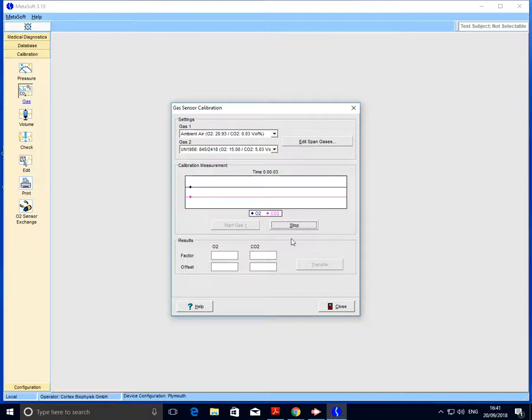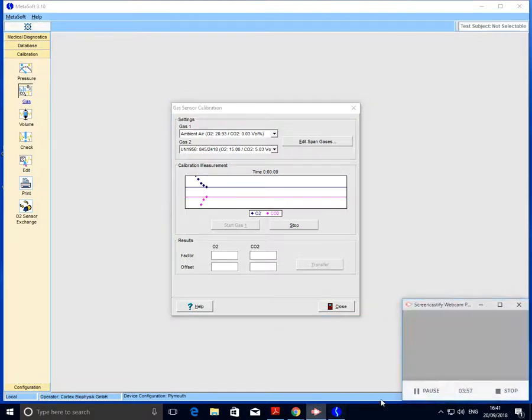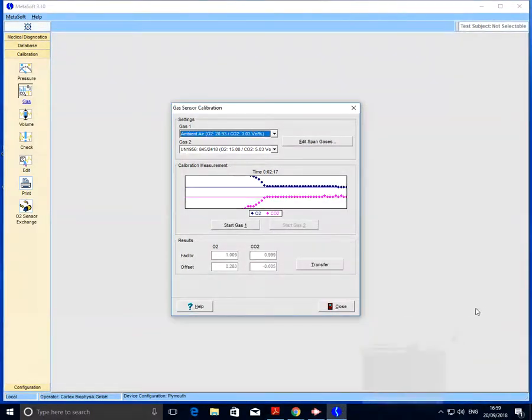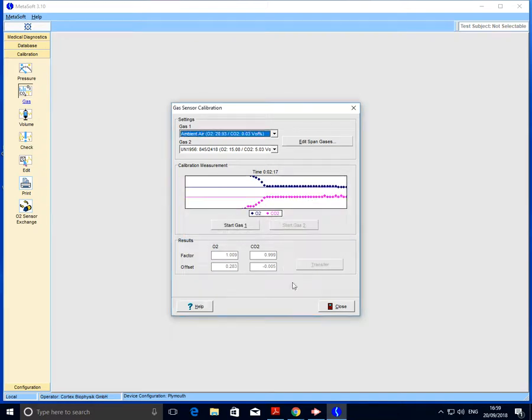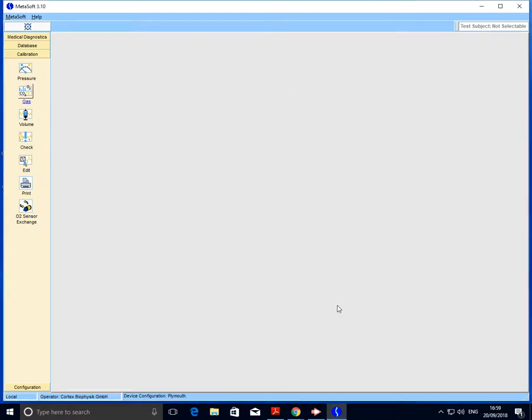Again, this might take a little bit of time, so I'm just going to pause the video so you don't have to watch this section. Okay, so gas two is now finished and we can go ahead and transfer those values. We'll hit transfer, click okay, and close.